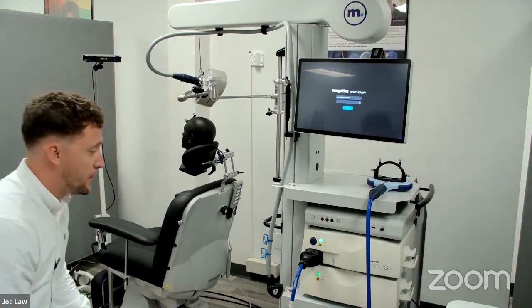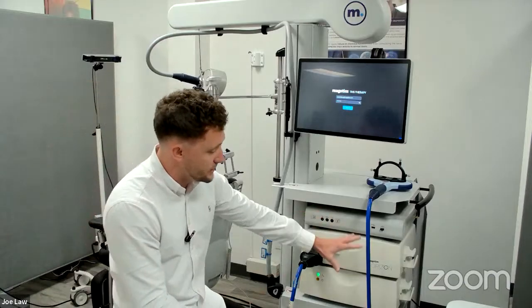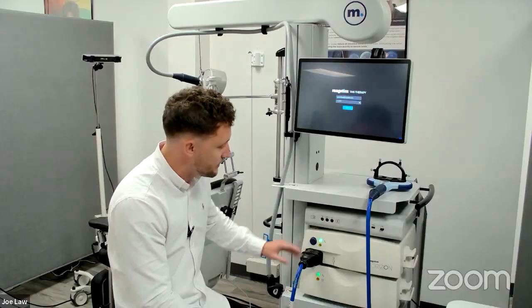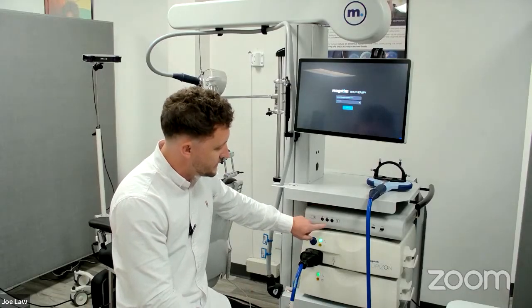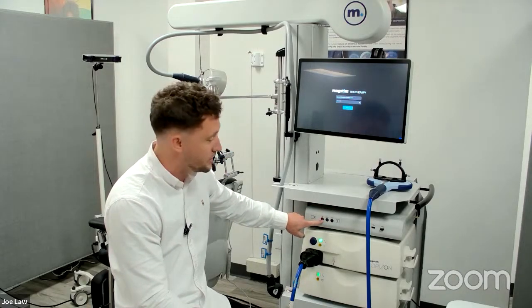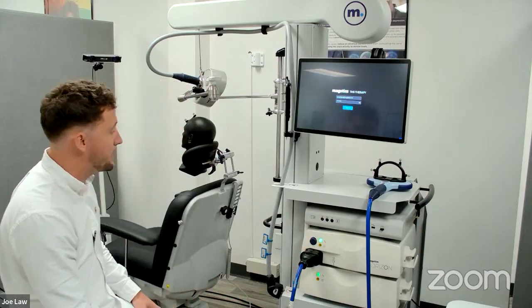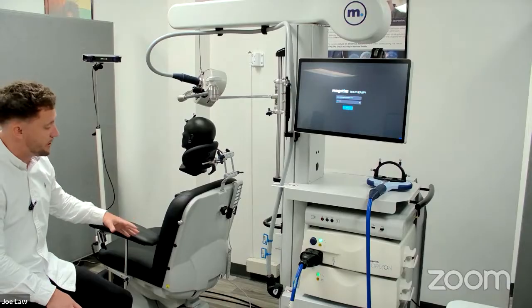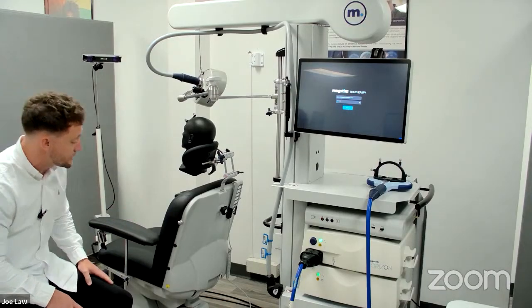So to start with the overview, we'll start with the main portion of the system here. This actually provides the energy to the coil to make the magnetic field, along with our customized PC with our EMG inputs. I'll speak a bit more about that during the mapping stage. This is our clinical treatment chair, the Magstim chair, fully remote, fully motorized.